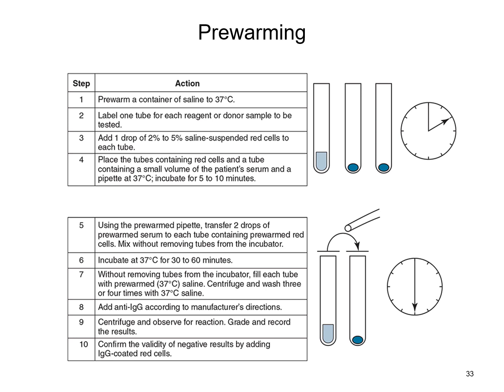Again, everything's pre-warmed, and while it's sitting in that incubator, you're usually going to let it incubate 5 to 10 minutes, whatever your procedure says. So that's the pre-warm period. And then everything's going to be in the incubator ready to go, even down to your pipette. Your pipette will be sitting in your samples. So you don't want anything to come in that's cooler to try to enhance those reactions. And you're basically going to pipette while everything is still in your incubator.